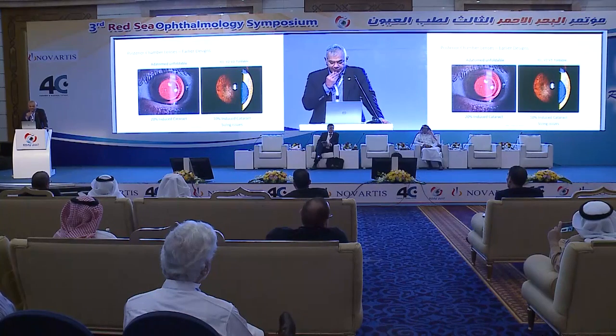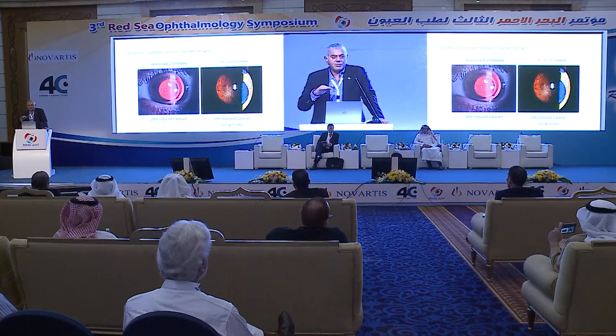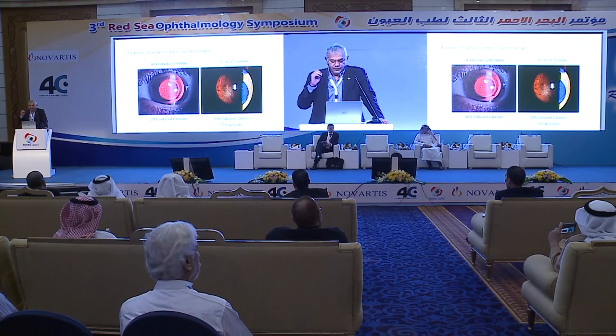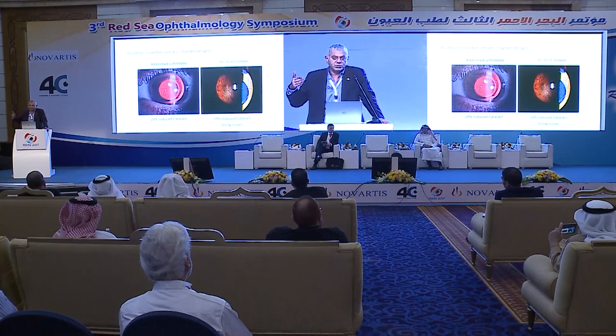The very old designs in the 90s from Adatomed were unfoldable posterior chamber lenses with 20% cataract. We did not use this. We stopped after one day. The earlier design of the ICL, and then V1, V2, and V3 had like 10% induced cataract, and I stopped using the ICL for more than 10 years because of this reason.